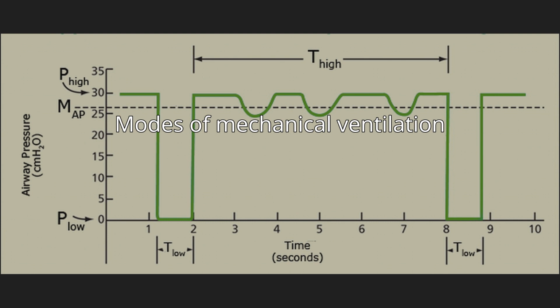The most frequently used forms of volume-limited mechanical ventilation are intermittent mandatory ventilation (IMV) and continuous mandatory ventilation (CMV). There have been substantial changes in the nomenclature of mechanical ventilation over the years. More recently, it has become standardized by many respirology and pulmonology groups. Writing a mode is most proper in all capital letters with a dash between the control variable and the strategy, i.e. PC-IMV or VC-MMV, etc.